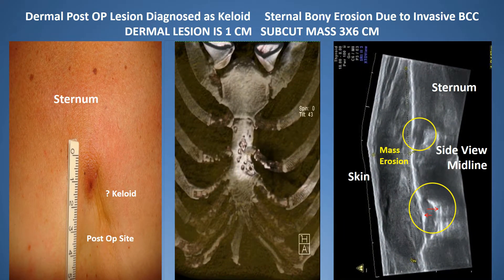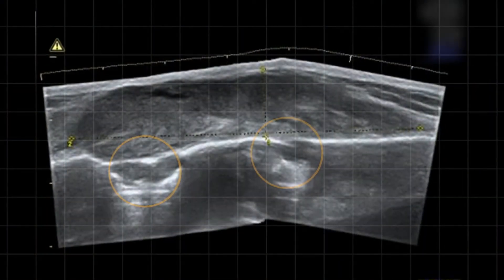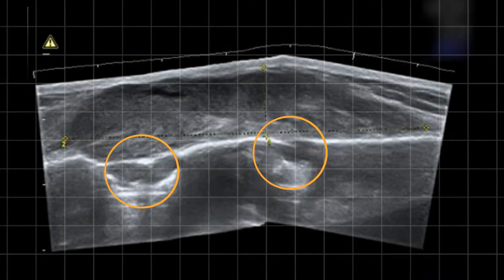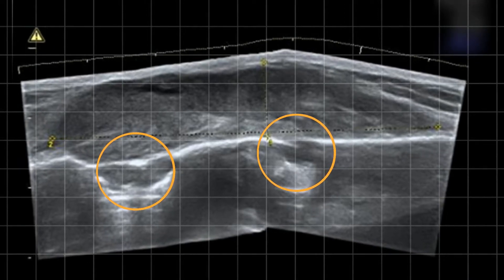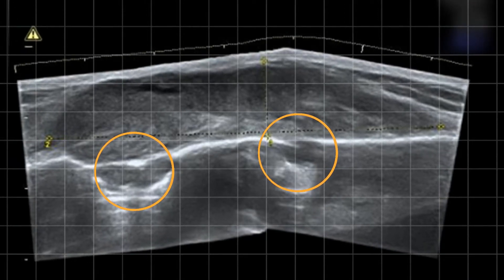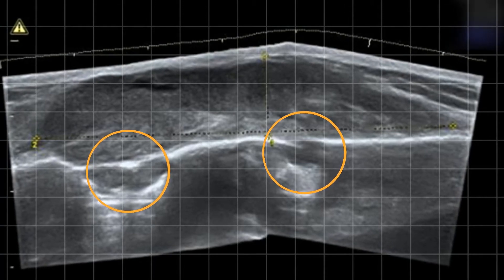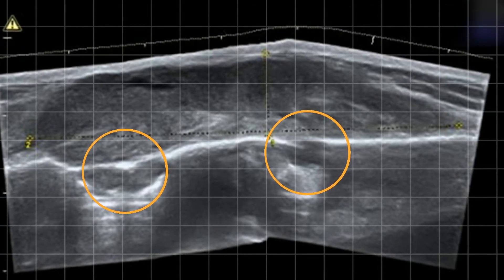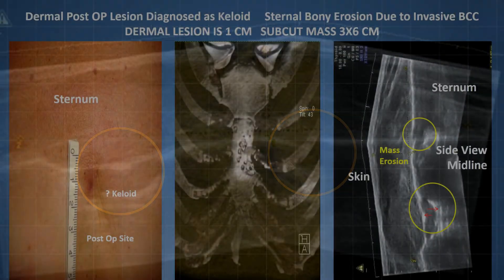This patient had a basal cell and developed a mass in the sternum. It was called a keloid, or they weren't sure what it was. On the side view, you can see within the yellow circles where it's eroding through the bone. As the small basal cell is spreading, the middle section shows it also appears on a CT scan. You can see the same finding when scanning the patient, showing it's a huge recurrence — requiring more than simple surgery.